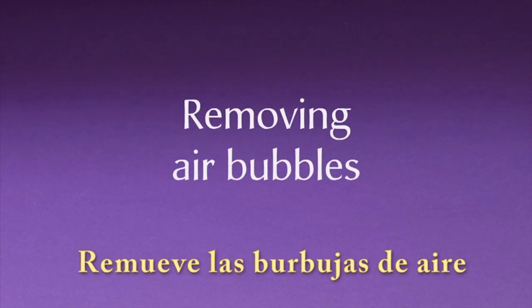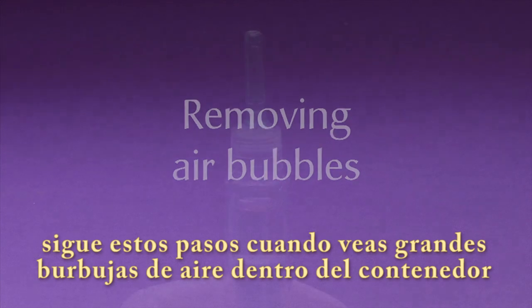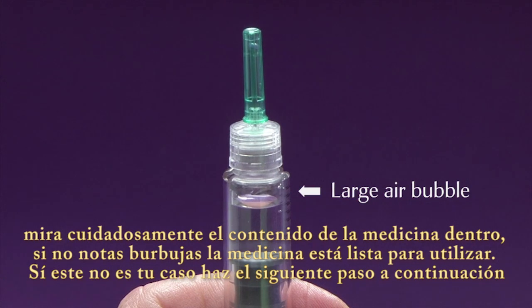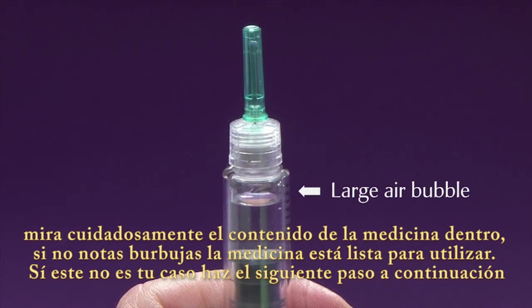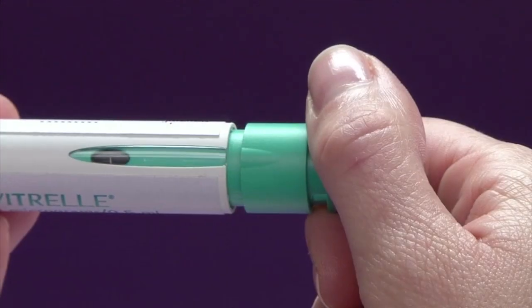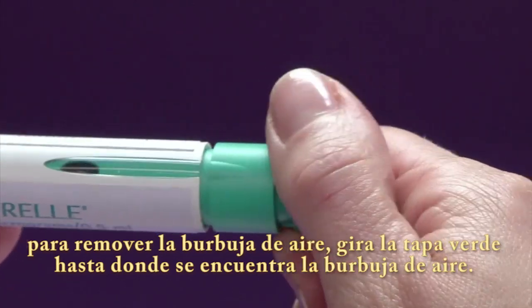Removing air bubbles. Follow these steps whenever you see large air bubbles inside the drug reservoir. Look carefully at the drug reservoir. If you don't notice any large air bubbles, the pre-filled pen is ready for use. If this is the case, move straight to step 2, setting the dose. To remove a large air bubble, set the dose setting knob to the dot.